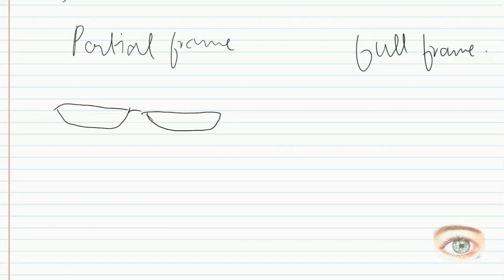They are also known as reading glasses. A full frame consists of a bigger diameter, so that for three distances, even if you want to have a bifocal or a trifocal, all the distances can be accommodated in these types.